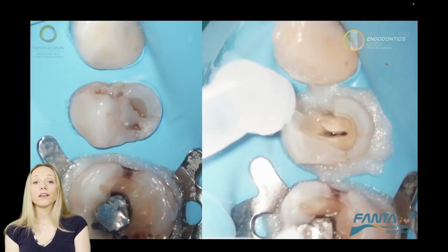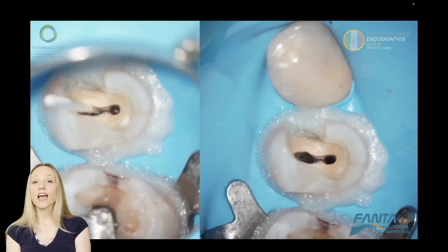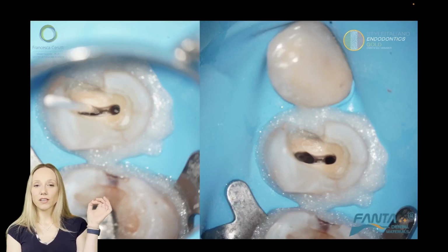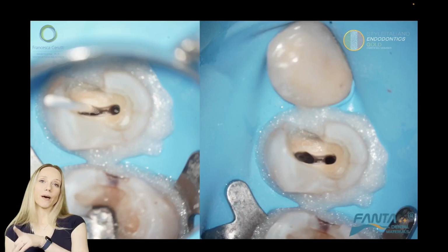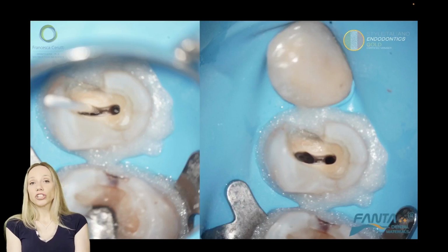So here is a premolar. Probably first premolar according to the shape of the crown. There is 1 premolar missing, the lady doesn't really remember, so I do the access cavity, I try to clean it, and as you can see, when I use my paper point, what do you see? From the palatal canal, you see the tip of my paper point, so there is a confluence that I spotted while I was doing the shaping.